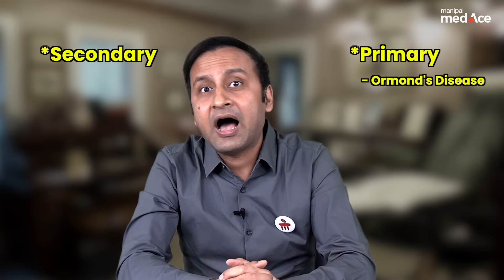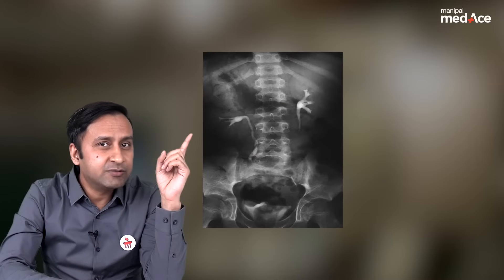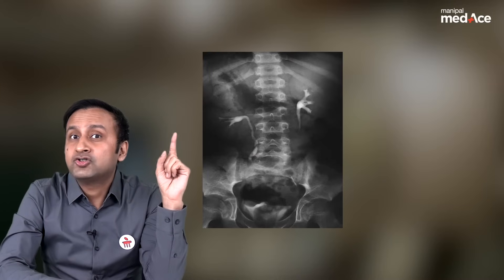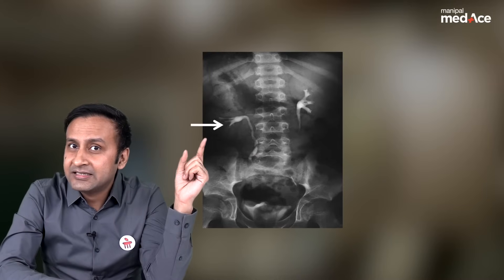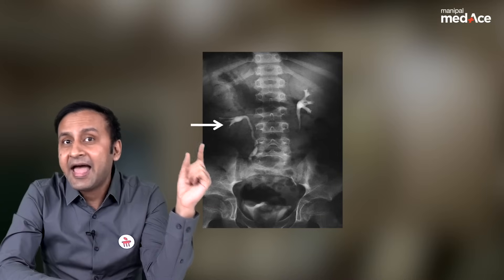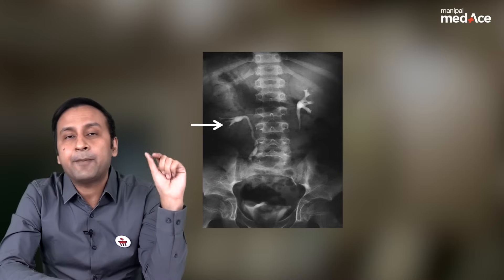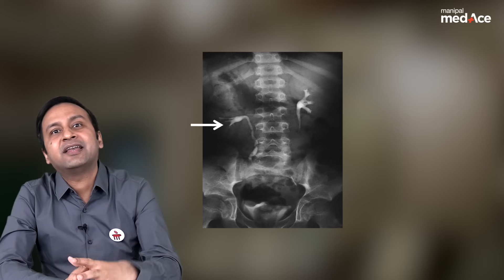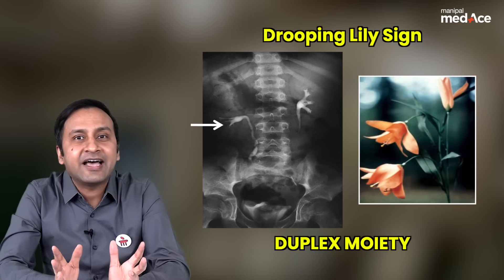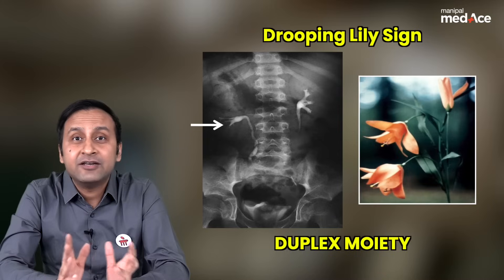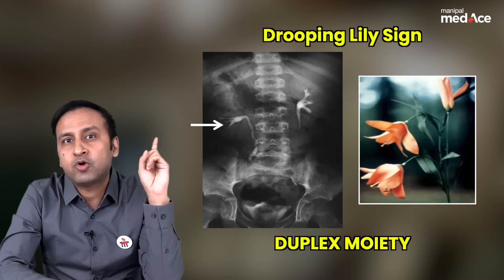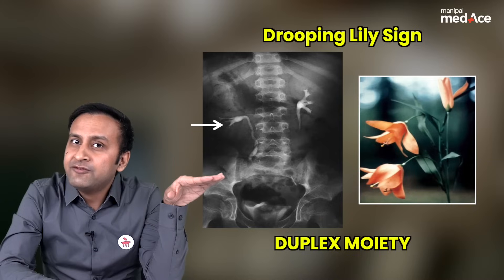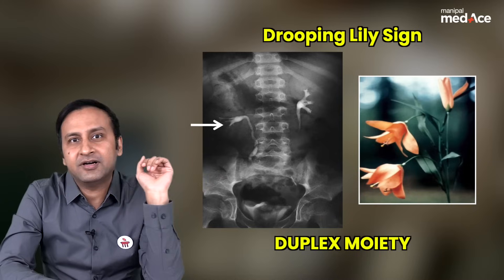Let's look at our next case. In this radiograph, there is non-visualization of the upper calyces of the right kidney and a drooping appearance of the lower calyces of the same kidney. This sign is called the drooping lily sign, and is a classical sign of a duplex moiety, in which the upper pole moiety is abnormally hydronephrotic and non-functional, pushing the normally functioning lower moiety inferiorly.